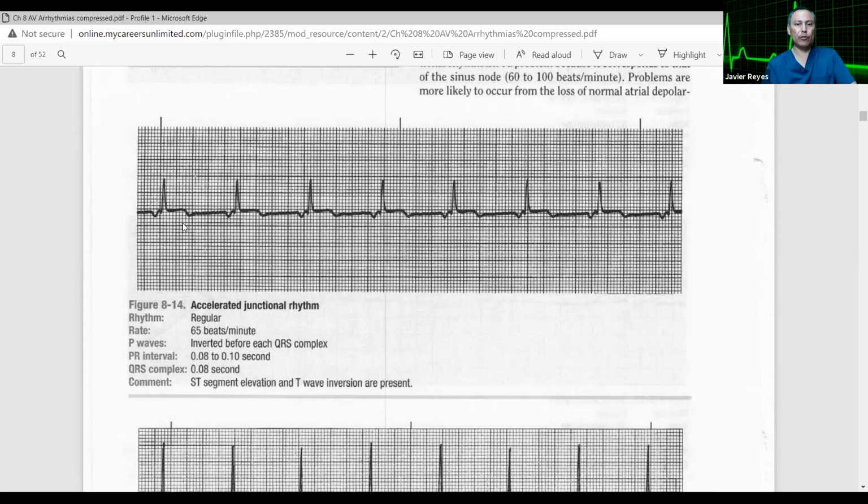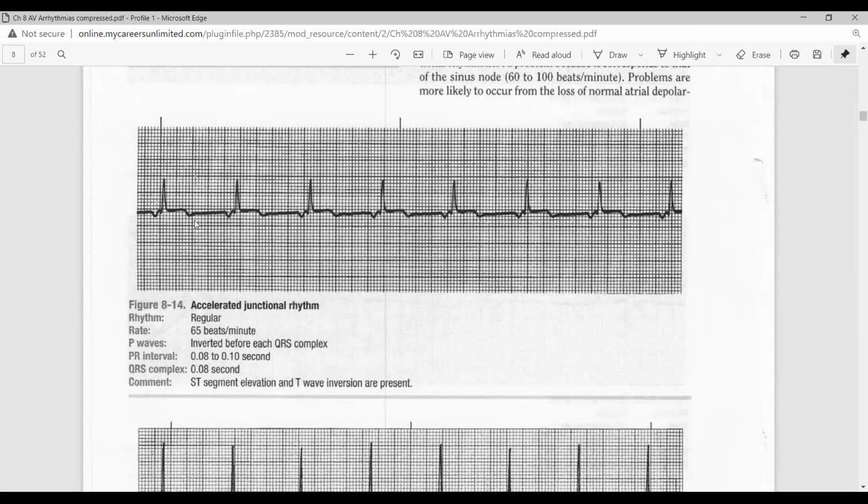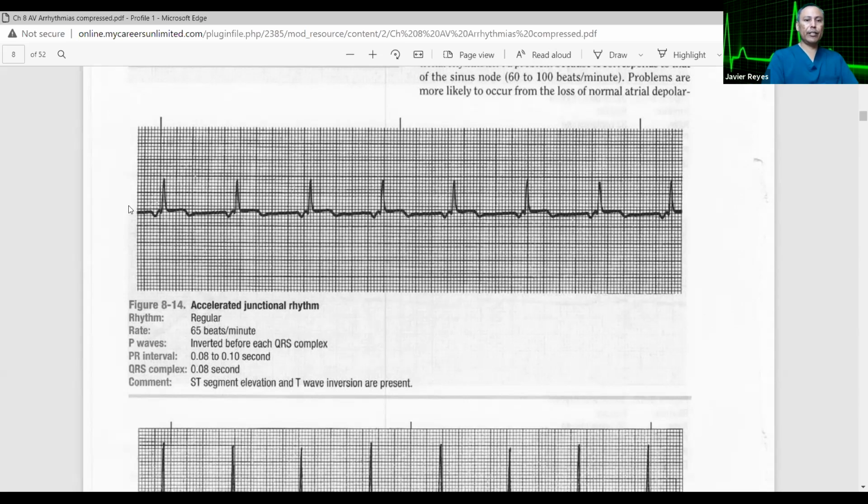Because there's probably dead tissue. Dead tissue rejects or does not allow the signals to pass down into the ventricles to get depolarized. So you have a retrograde flow in the ventricles. Now you got a serious problem. ST inversion is a serious problem. So when the T's inverted, it's serious. Anything with the ST segment or the T wave, that is a problem.